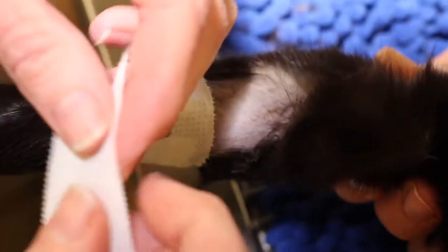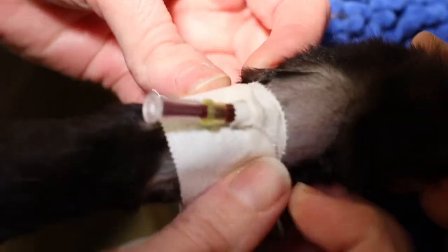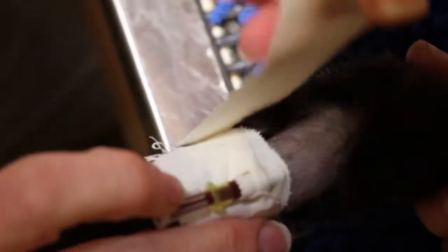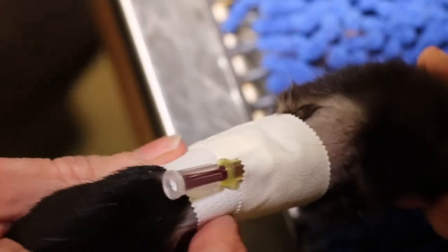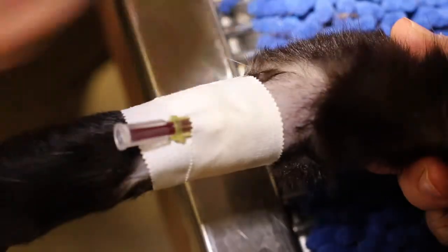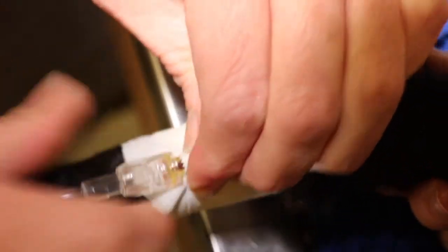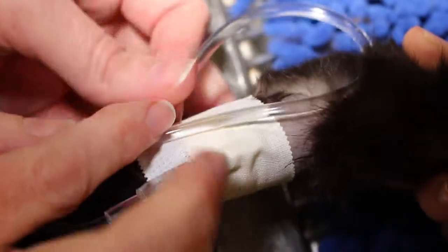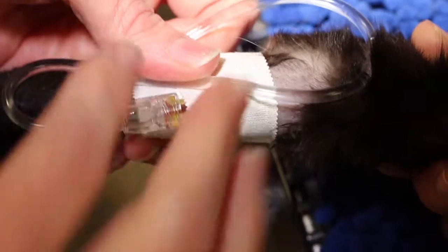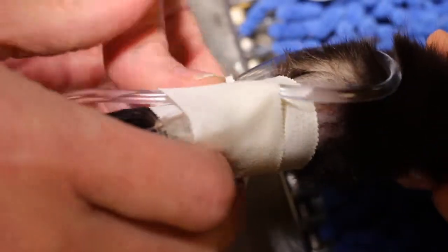I take a full piece of tape and make a small tear in the end. I slide that up under the catheter and that's going to protect me from getting any fur in the catheter. Then I roll the top around again to secure that catheter. On this patient we're going to hook up some fluids, so instead of putting an injection cap on, I take this cap off and hook up my fluid line. Now I'm going to make a stress loop — I pull up a piece of the extension set and fold it on itself. I take another piece of tape and secure that stress loop, going over the junction with the catheter, so that holds the stress loop in and protects the junction as well.